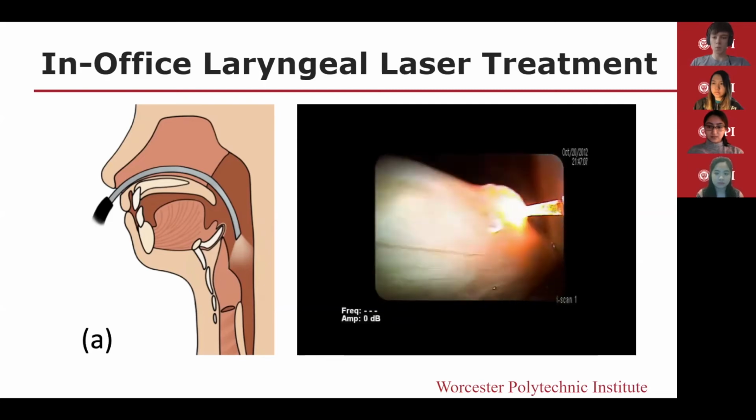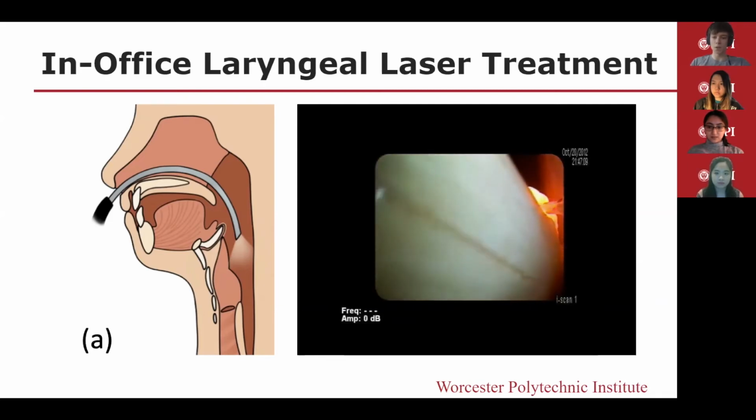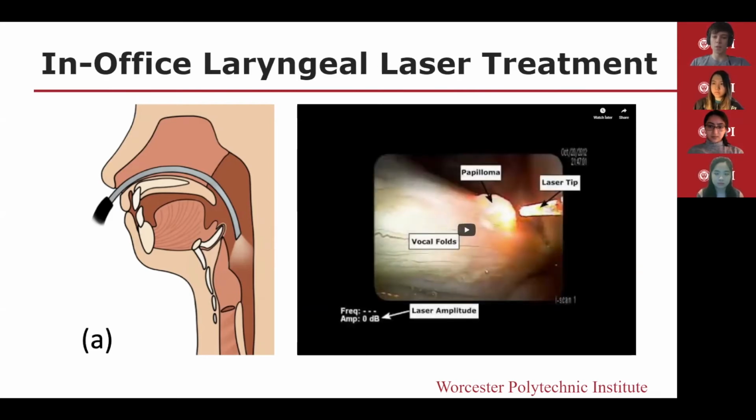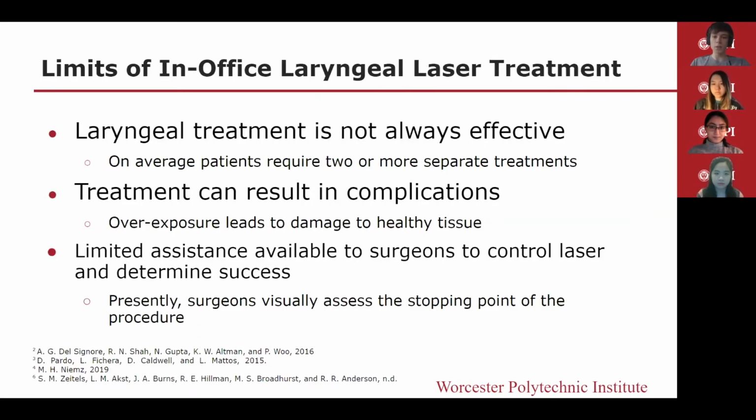This procedure is performed in a doctor's office as opposed to in a surgical operating room. And this presents numerous benefits. It saves time and money, and the patient does not have to undergo general anesthesia. However, there are some limitations of this procedure.